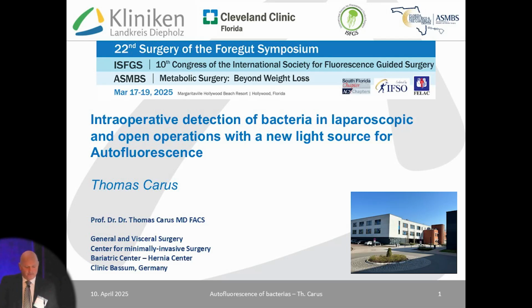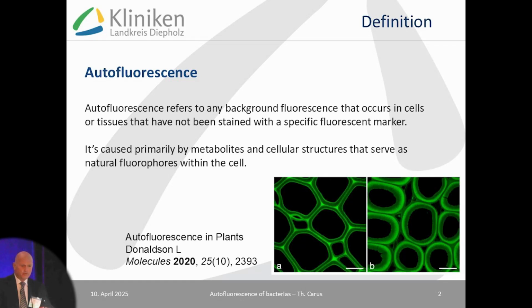After this highly scientific presentation we heard in the last 10 minutes, I come to a really practical topic, just to show bacteria during operation, laparoscopic operations and open operations, by their autofluorescence if we use a special light source. We all know about fluorescence, but autofluorescence is not so well known in surgery.